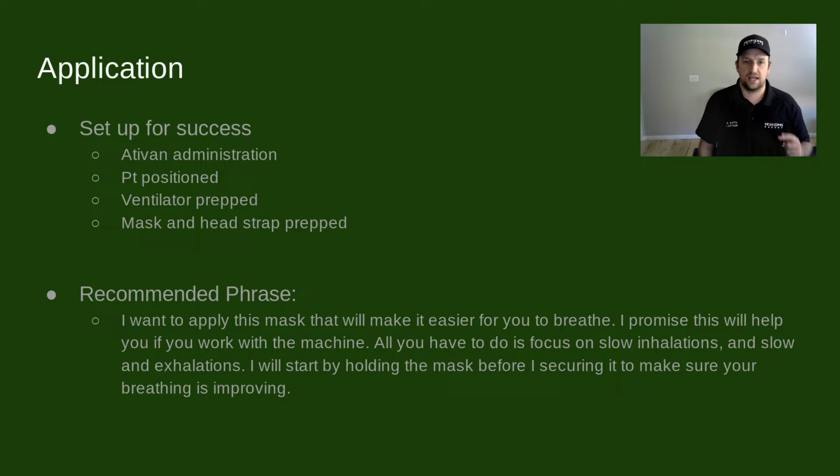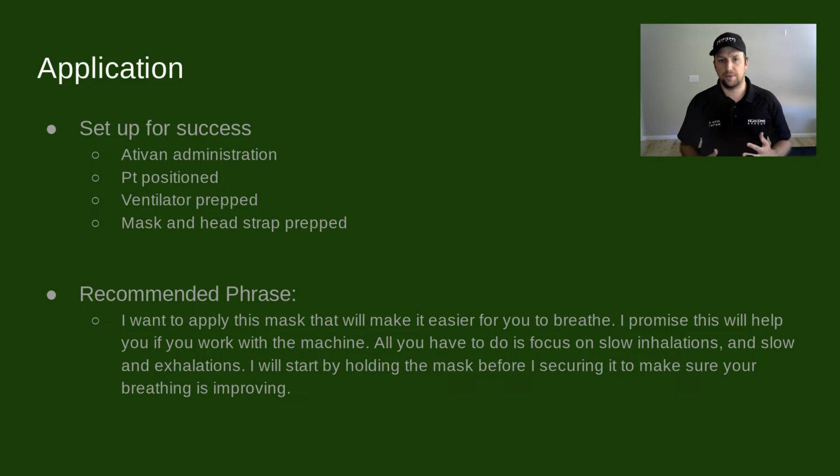Last thing is I have a recommended phrase. Often you'll hear people say, this is really going to suck or it's going to be really hard. If you're having a hard time breathing, that is the last thing you want to hear. So let's read this phrase and see if you think it's a little bit better. I want to apply this mask that will make it easier for you to breathe. I promise this will help you if you work with the machine. All you have to do is focus on slow inhalation and slow exhalations. I'll start by holding the mask before I secure it to your face to ensure it's improving your breathing.